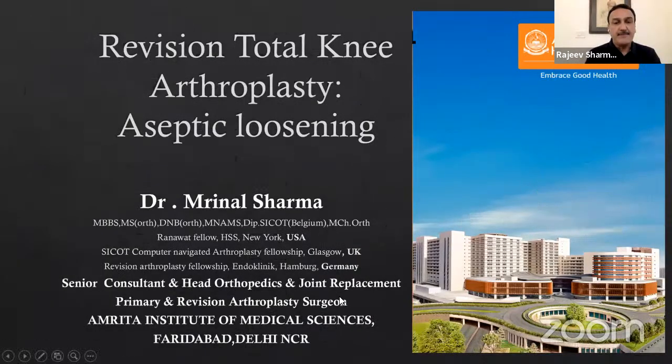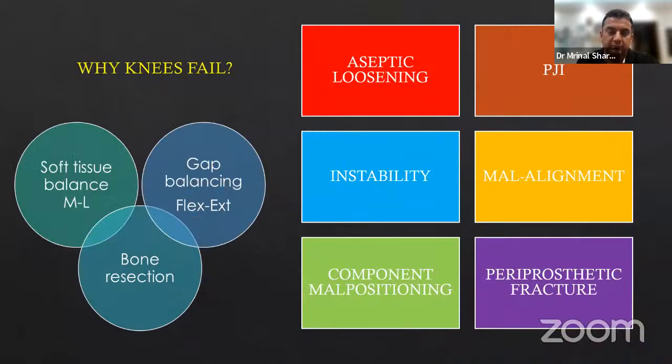Yeah, so I'll be presenting a case on aseptic loosening. Aseptic loosening is the second most common cause of revisions after infection. Earlier, it used to be pretty high and used to be the number one cause for revisions, but now it has come down because of the improvements in the poly.